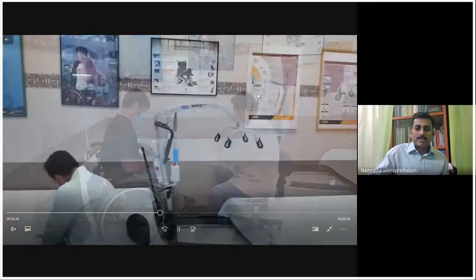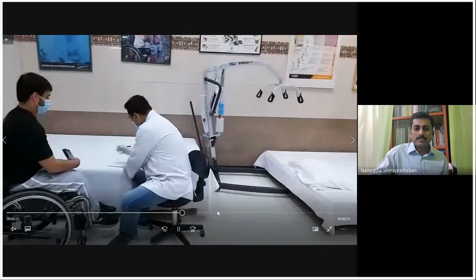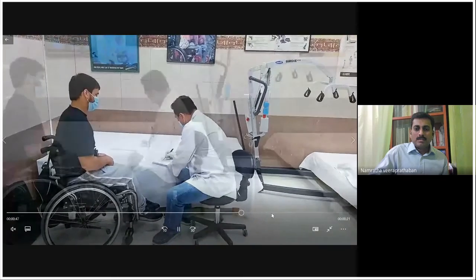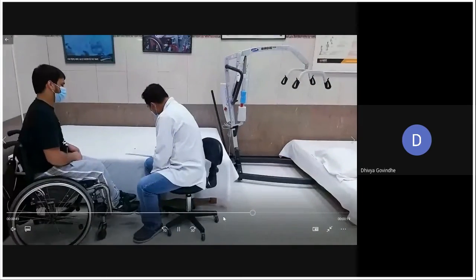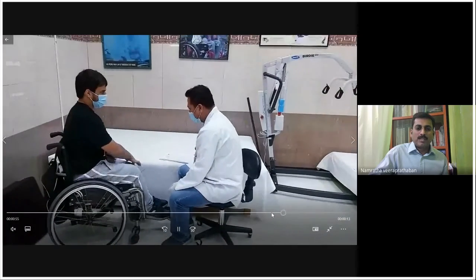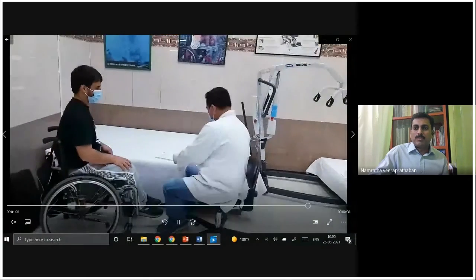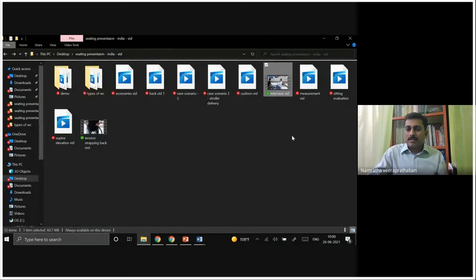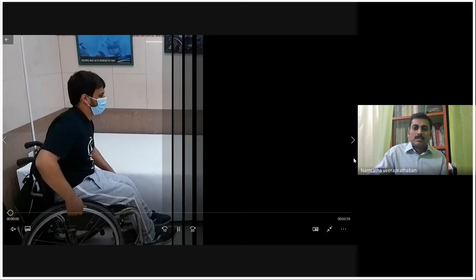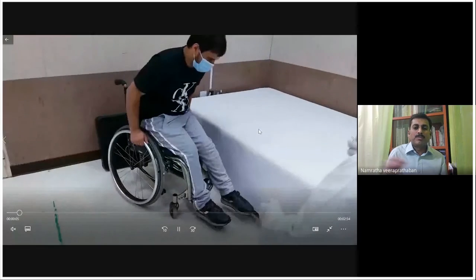We have a well-defined assessment form. He's just filling in all the interview details. Okay, he's asking about his hamstring release. Okay, he's documenting it. From there, in the seating process, we said assessment, interview, observation, then it goes to supine evaluation now.